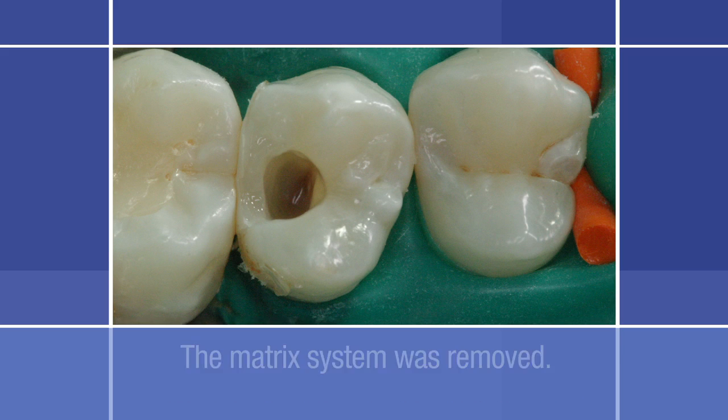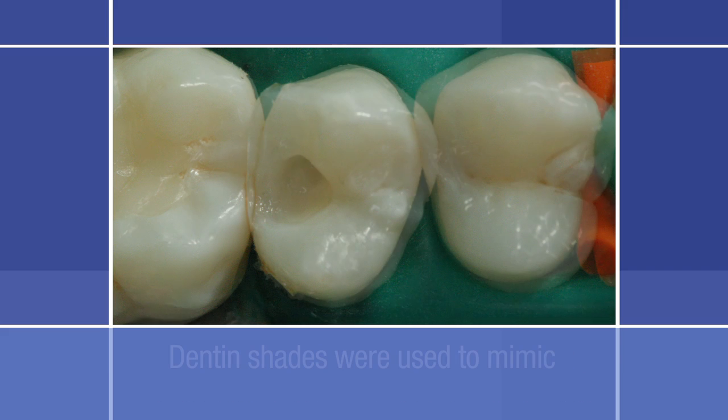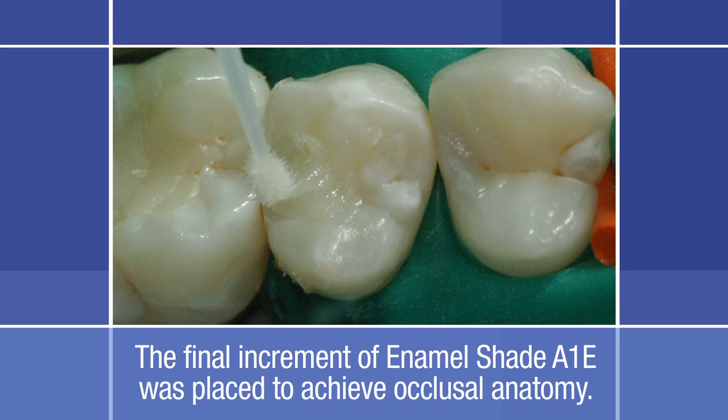The matrix system was removed. Two successive increments of dentin shade A2D were placed and light cured. The dentin shades were used to mimic the look of the natural dentin. An oblique layering technique was used to minimize shrinkage stresses. The final increment of enamel shade A1E was placed and shaped in order to achieve the occlusal anatomy. The goal in this step is to apply only as much composite as needed to sculpt the restoration to as near final contour as possible.